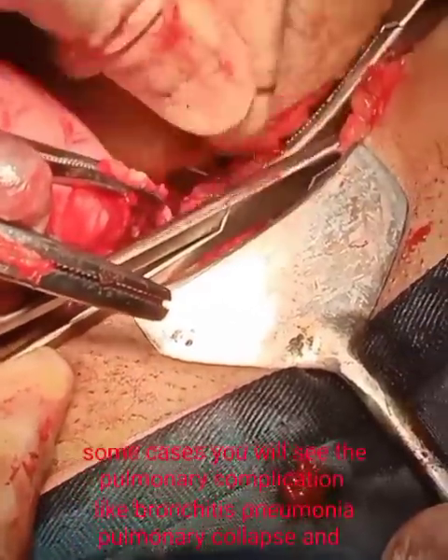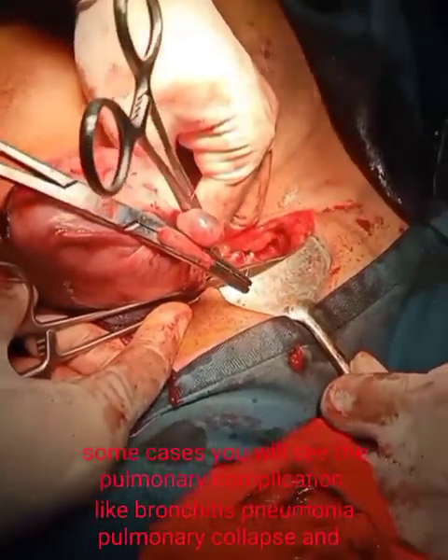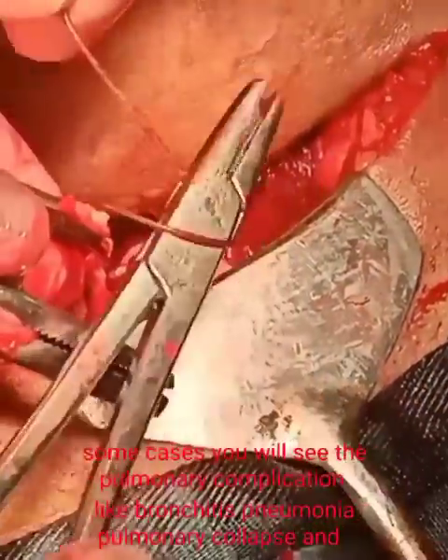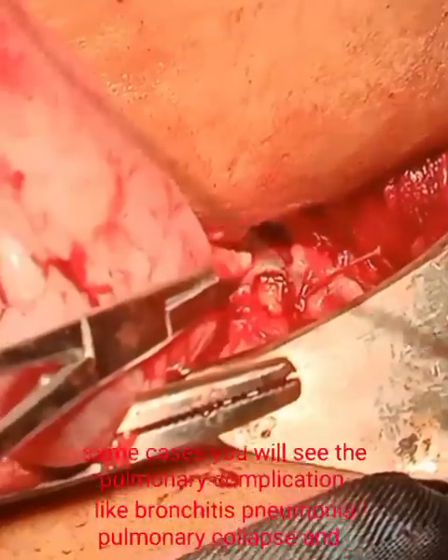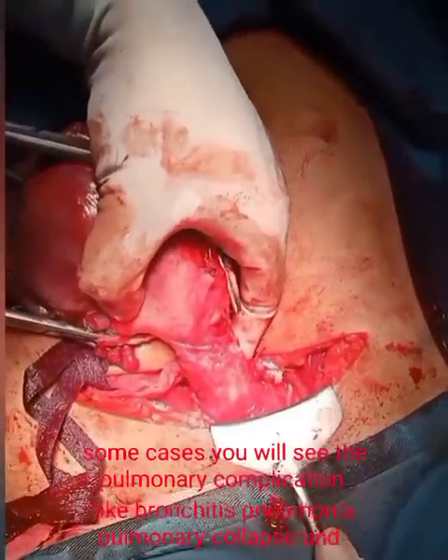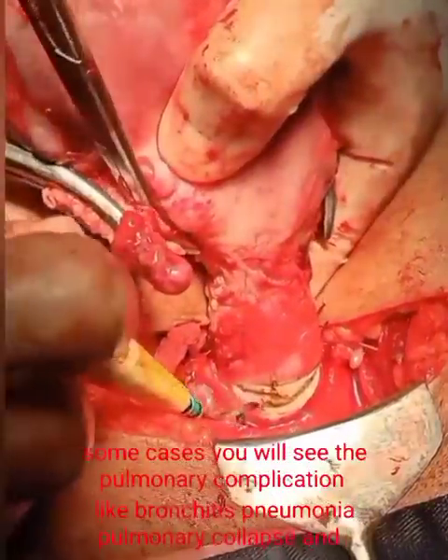If the operative technique is poor and the rectus sheath is not completely closed, leaving defects, incisional hernia may occur. We are ligating all blood vessels and pedicles, securing the bleeding, and will now remove the uterus with the cervix. Using the electrocautery I am opening the area circumferentially and removing the cervix.